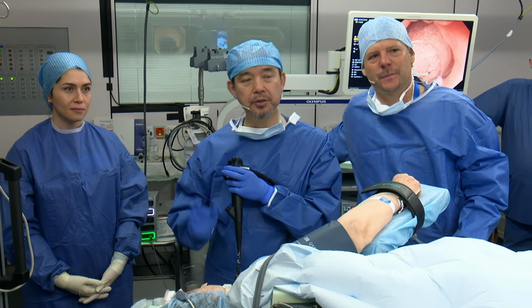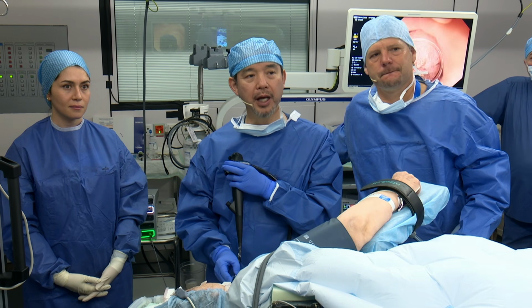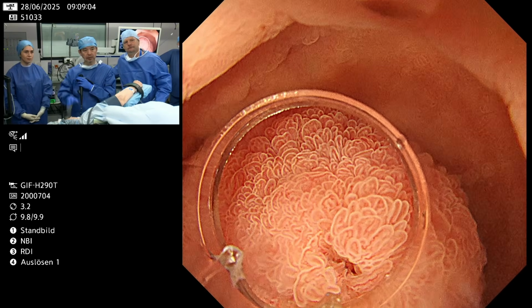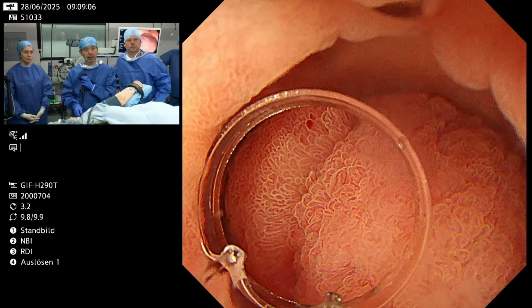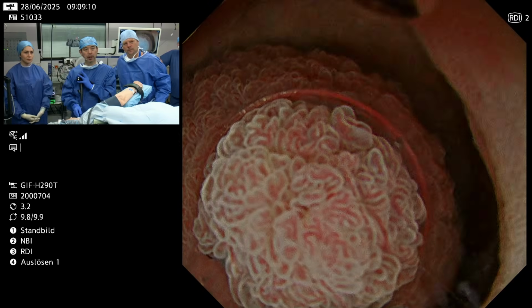And as you heard before, we have this duodenal adenoma, and we just already have a look at the lesion. Would you like to comment, like to characterize this lesion? This is around a 3 centimeter lesion located at the duodenal bulb, and as you can see here, it has a relatively homogeneous surface structure, and there is no WOS. WOS means white opaque substance.